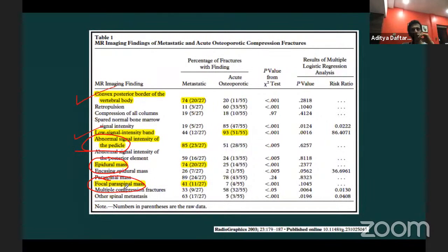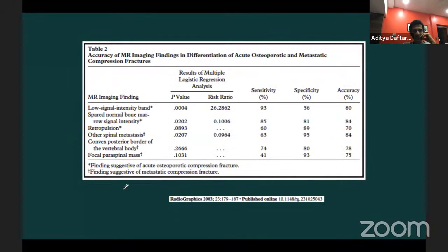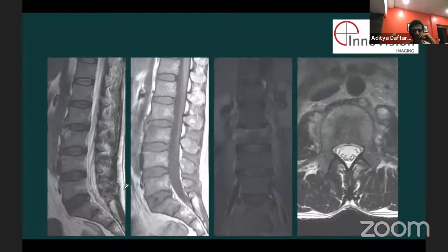And I think Harshit touched on most of these very well. So hopefully most of you have understood how to differentiate these, or at least how to help yourself think about these things. Okay. Any questions on that? Or should we keep going with the next case? Let's see what other questions we have.